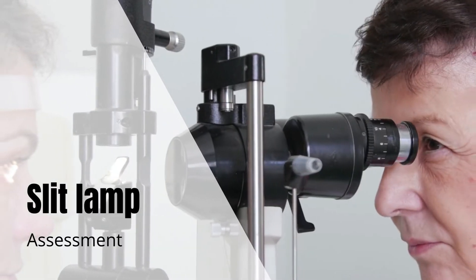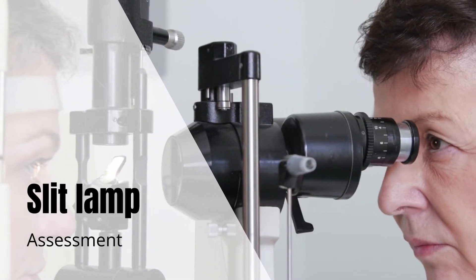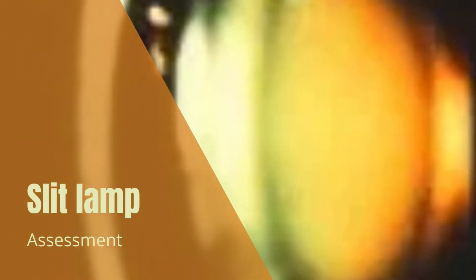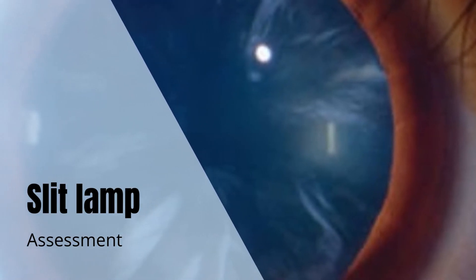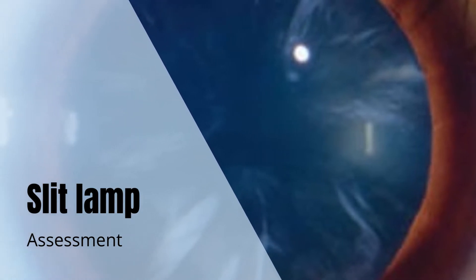Slit lamp examination is done for cataract grading, corneal details, and fundus examination. Nuclear cataracts are graded according to their color and opacification using slit lamp examination. Cortical and posterior subcapsular cataracts are graded instead using retro-illumination.